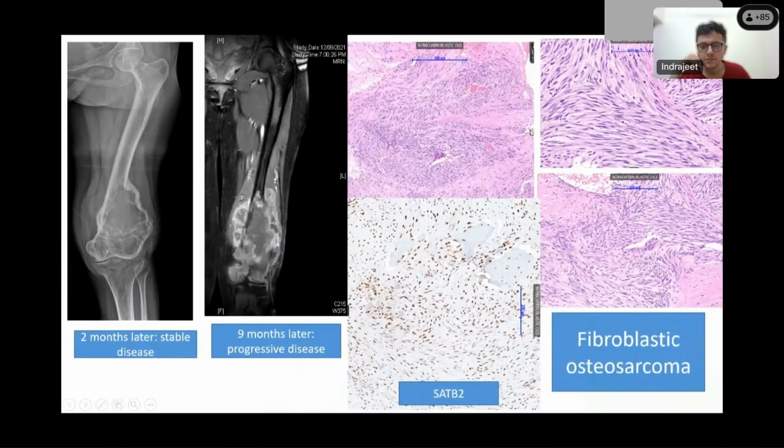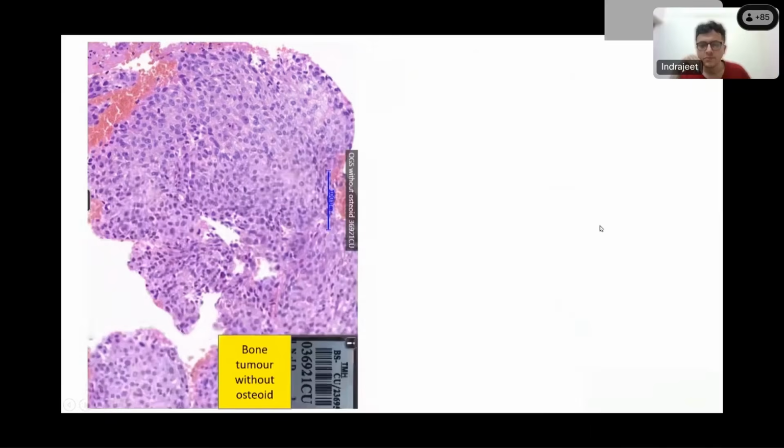You should always know the spectrum of any given tumor, as to what is possible in a given spectrum. So now this tumor, Srilata, what can you say? Yes, ma'am. We are seeing a tumor with cells showing little epithelial-like morphology. Yes, correct, you're very right.